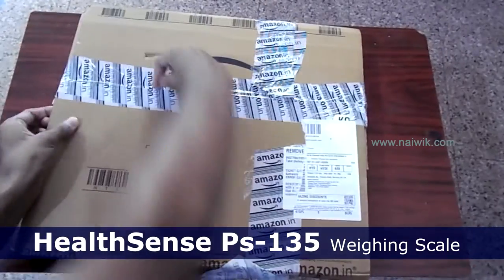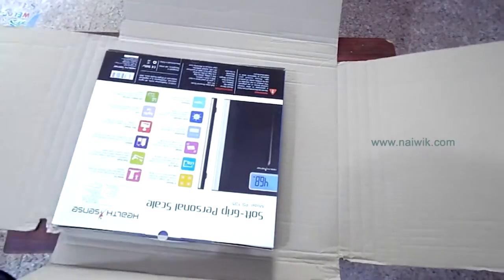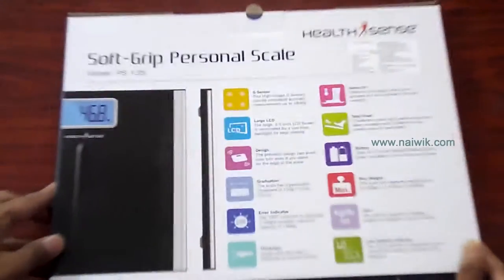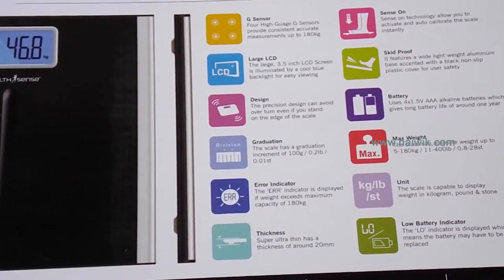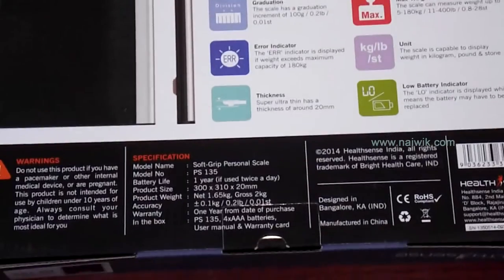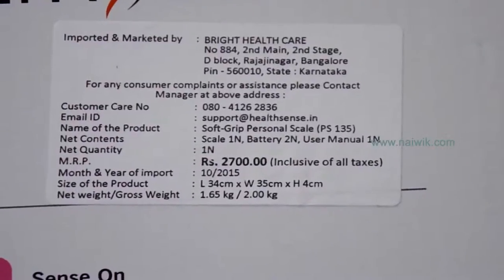Hi friends, in this video you are going to see the unboxing of HealthSense PS-135 weighing scale. Here is the weighing scale box. On the back side you can see the features of the weighing scale. Notable features of this weighing scale are G-sensor technology, a large LCD, good battery backup, and an error indicator.